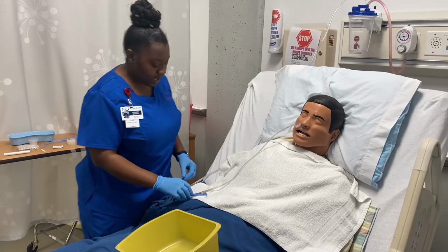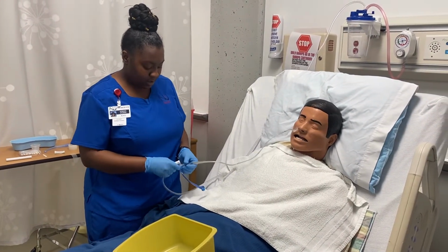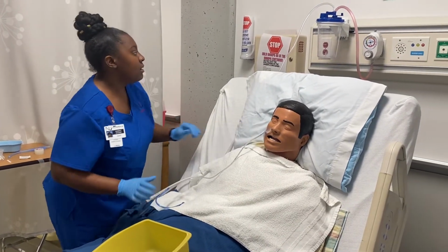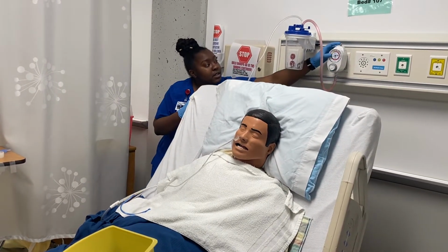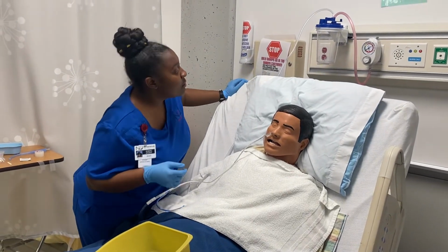And then after that, I'm going to attach this tubing to the suction machine. Make sure there's no creases or anything. I'm going to do it intermittent. Perfect.